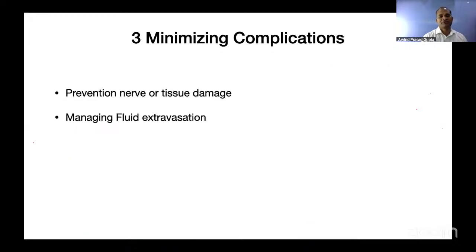So doing any meniscus work here or lateral collateral ligament type of surgery, be very careful about common peroneal nerve injury. At the same time, fluid extravasation management is also very important, particularly if you are doing work on the posterior side or doing arthroscopy in an acute setting, because in the calf, many a time the fluid is extravasated, and that may lead to compartment syndrome.